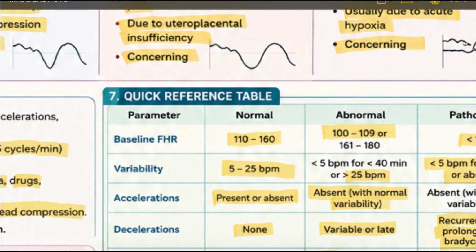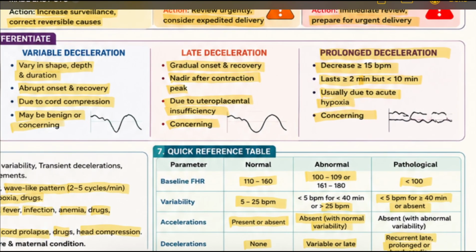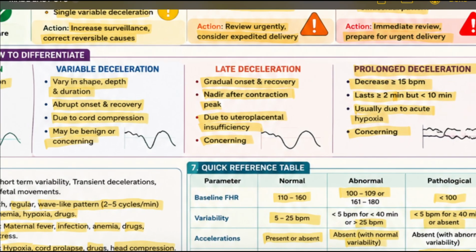So next, if the patient has any problem, how to do management with intrauterine resuscitation? We have some methods to treat late, recurrent, variable decelerations by increasing oxygen delivery to the fetus. For example, if you're suspecting inferior vena cava compression, we have to roll the mother to left lateral decubitus position. Next, if you're suspecting hypotension, we have to give intravenous fluids. If we are suspecting uterine tachysystole, we have to stop oxytocin and consider terbutaline. And if it's oligohydramnios or cord compression, we have to do amnioinfusion.